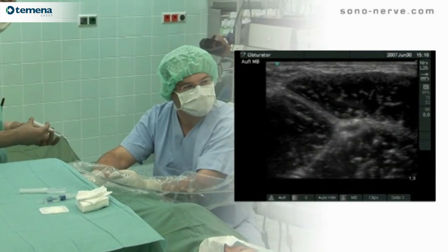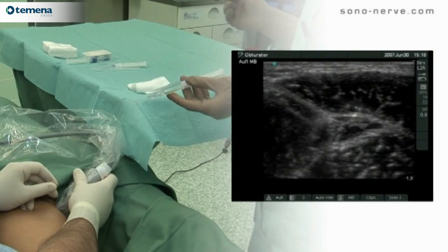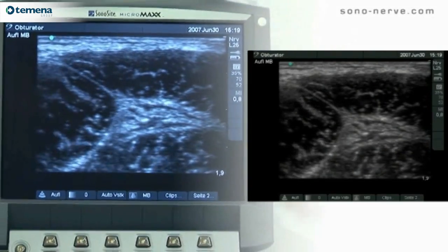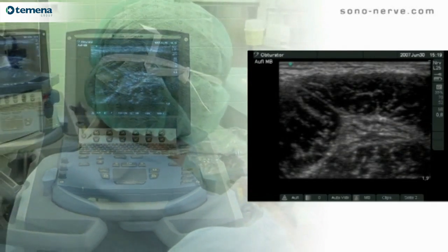Because of the fascial planes around the nerve, it's often difficult to visualise the nerve, and often it isn't until you start to inject the local anaesthetic that you can clearly see the nerve bundles. This triangular appearance is typical because the local anaesthetic spread is limited by the fascial planes.